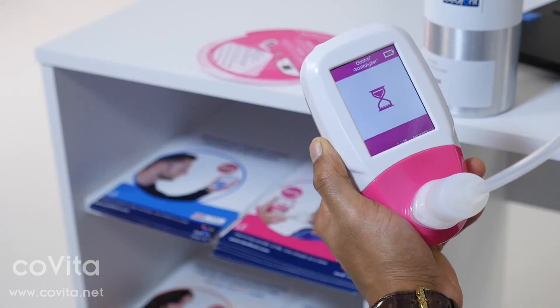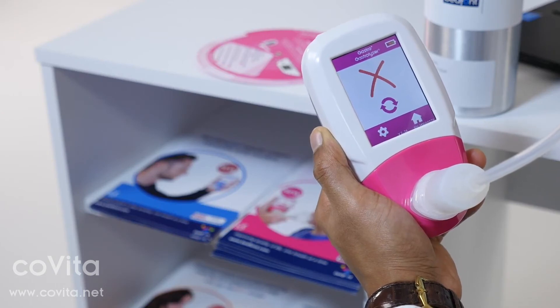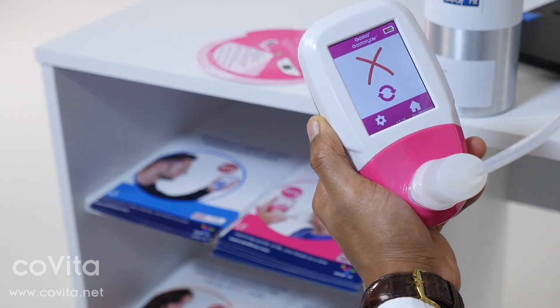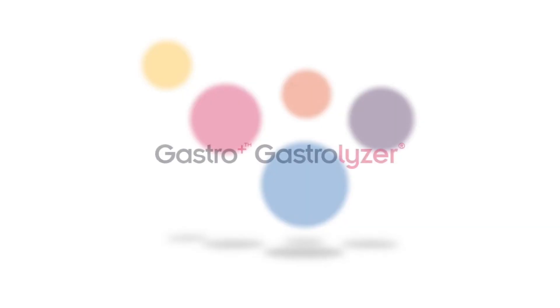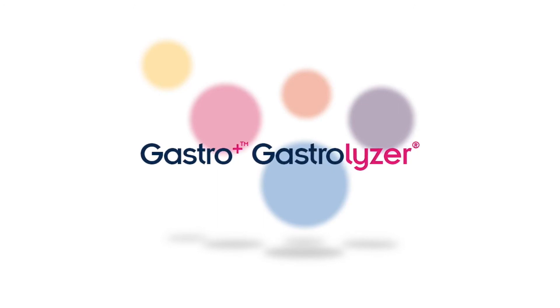If calibration has failed, a red cross will be shown on screen. Press the retry icon to reattempt calibration. If this problem persists, please see the troubleshooting section of the manual or call your local supplier of Bedfont products.